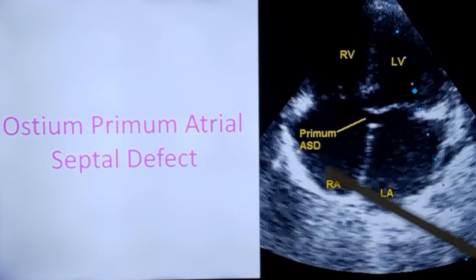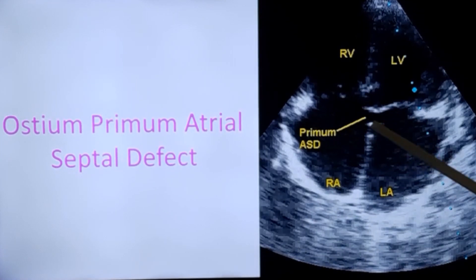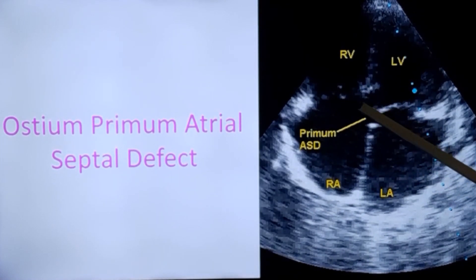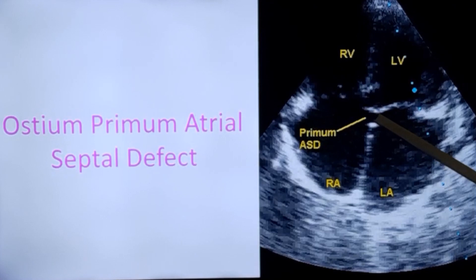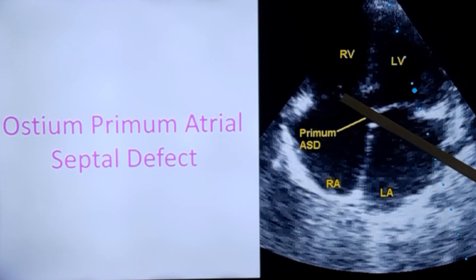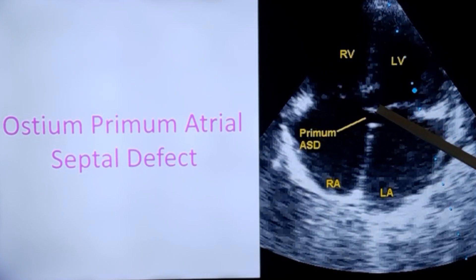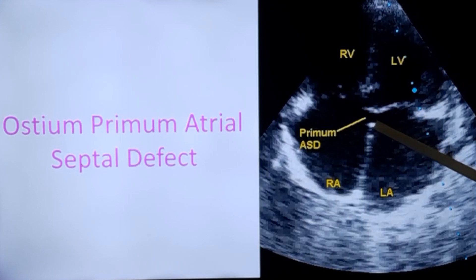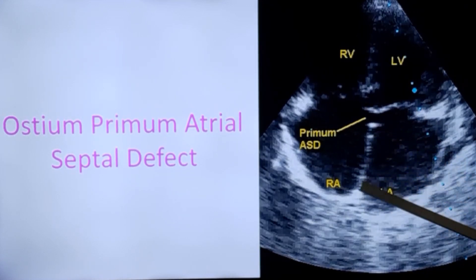This is an ostium primum atrial septal defect. You can see that there is no rim of tissue between the atrioventricular valves — the mitral valve here and the tricuspid valve here. There is no rim between the ASD and the AV valves, while the rest of the atrial septum is intact.